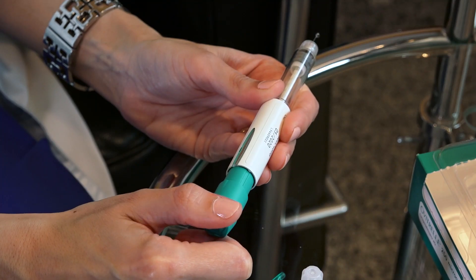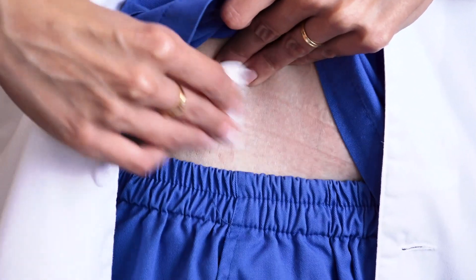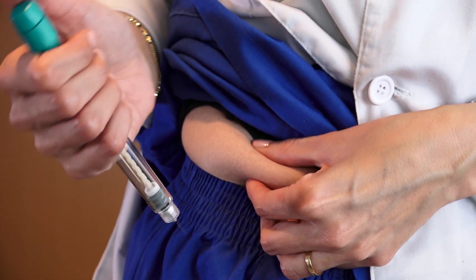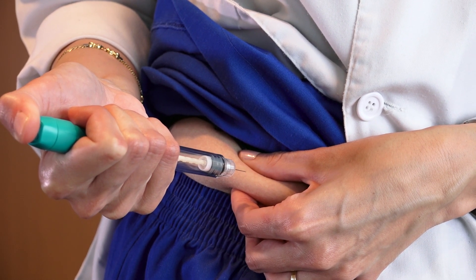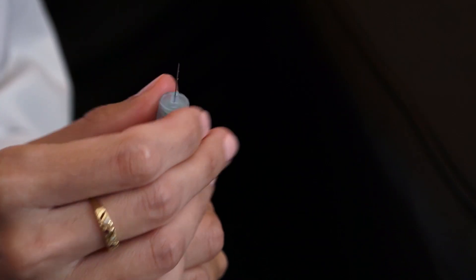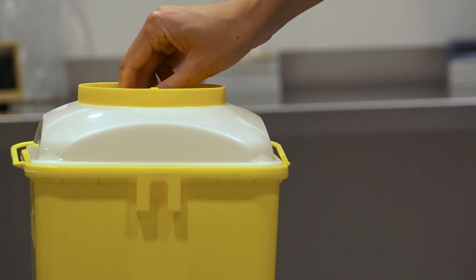Once the needle has been positioned and the dose has been selected, proceed to administer the medicine. Ovitreal is administered subcutaneously into the abdomen. Before injecting, use alcohol to disinfect that part of your body. Pinch your abdomen to make a fold and inject the medicine by pressing on the top part of the device until the entire amount has been injected. Following administration, remove the needle and dispose of it in an appropriate bin.